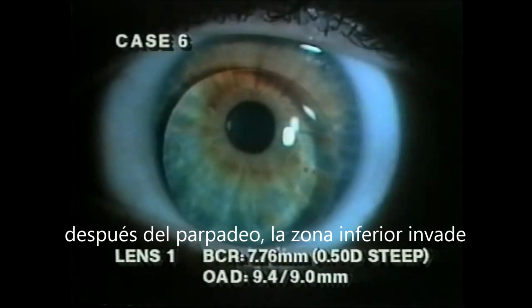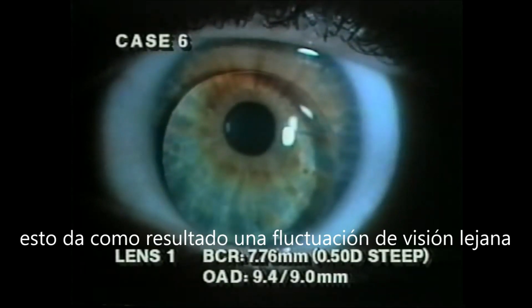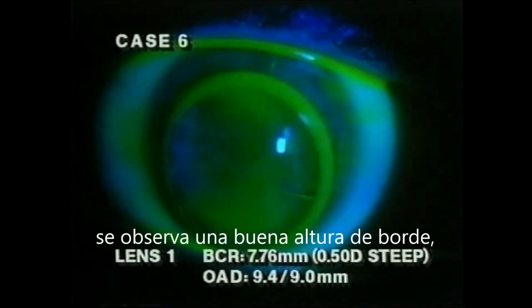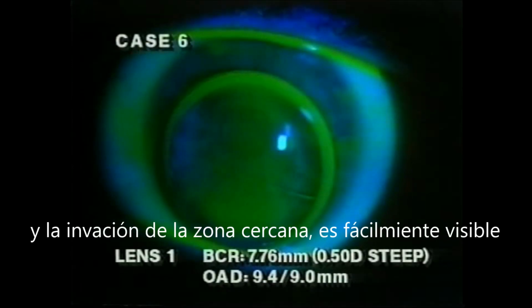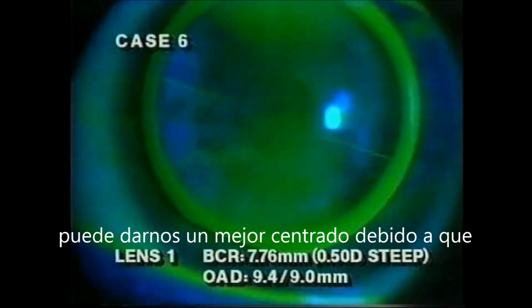However, the inferior near zone is lifted too far superiorly with the blink and also moves in front of the pupil. This may result in fluctuating distance vision. The steep fitting relationship is confirmed with fluorescein, showing central clearance and mid-peripheral bearing. The lifting of the near zone into the pupillary region is easily observable under high magnification. Selection of a flatter base curve radius may both minimize the interaction of the upper lid and improve the lens to cornea fitting relationship.